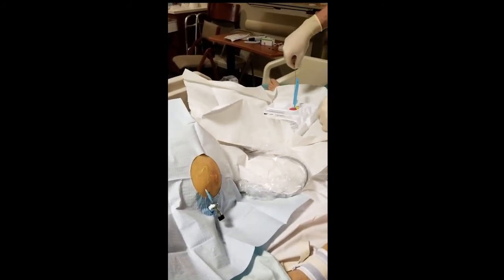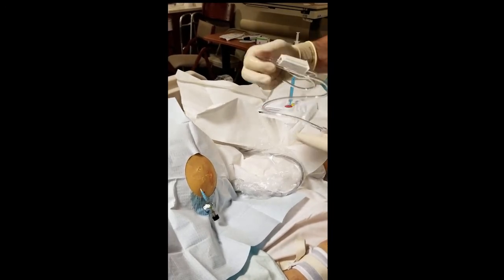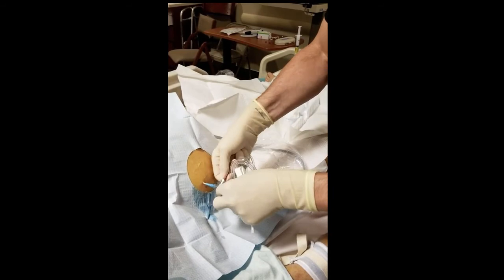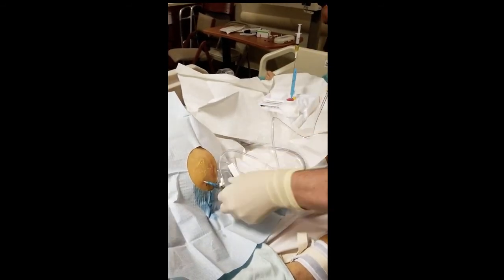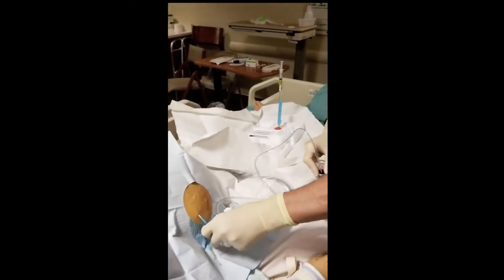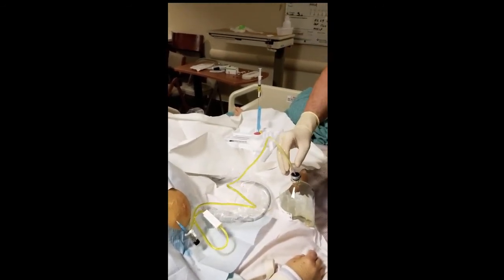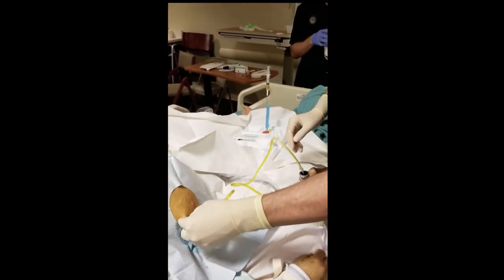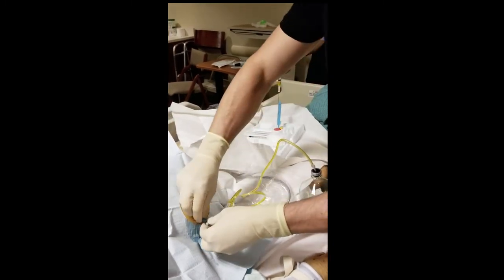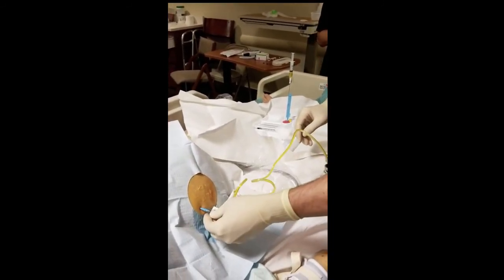Now I pause for a second. The next step is to use vacuum container bottles for drainage. I'm going to hook up. Notice here that this stopcock is off right now — you can leave it off until after you get your bottle. We'll rest the bottle here, then turn the stopcock so now it's on. Occasionally you might need to manipulate the catheter if it gets up against the bowel to allow fluid to come out. We allow it to drain, and that's it.